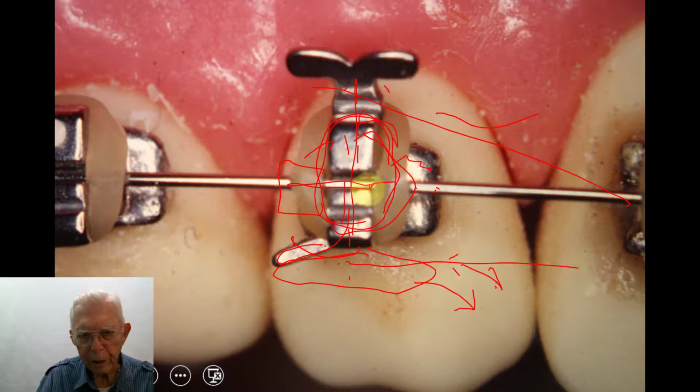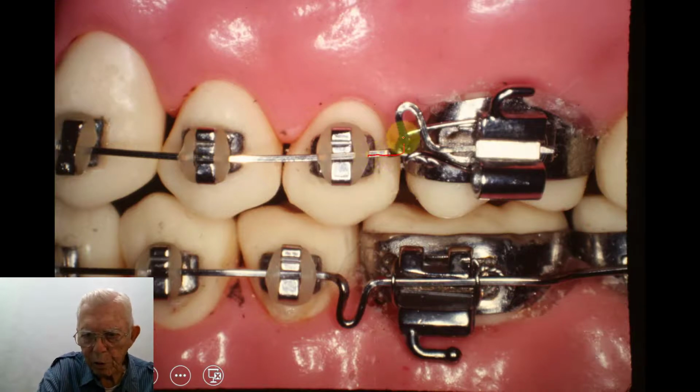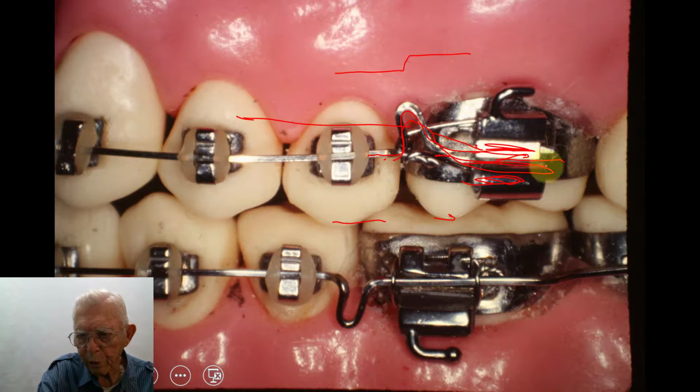And I know people spend a lot of money trying to come up with a perfect bracket, but nobody's ever done one that I know of right now. So we'll just go on from there. Here is the back side. We make this omega that goes in here, and I bring the omega out to the side, since this tooth is more narrow than the molar. Now the wire is coming on and comes out like that back here, and you bring it around here. If you have a headgear, you slide it in that slot. If you put no lip bumper or something, or an intruding wire, you would go in this one, and your regular arch wire goes in the middle one down here.